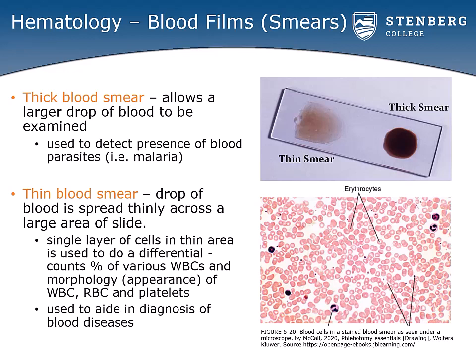From the collected CBC tube, an MLA may be asked to prepare a thick or a thin blood film so the lab technologist can perform some manual tests. Thick blood smears are most useful for detecting the presence of malaria parasites, since these blood parasites are present in low numbers, and a large sampling of blood can be analyzed with a thicker smear.